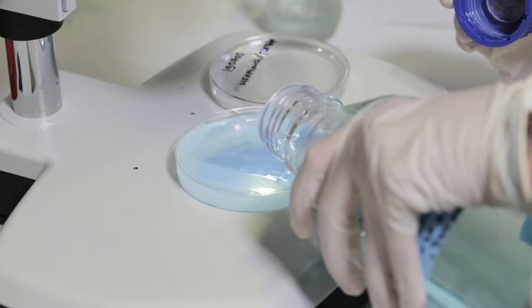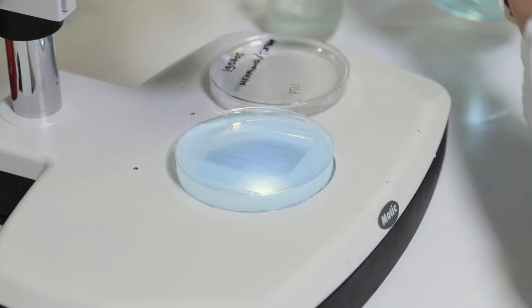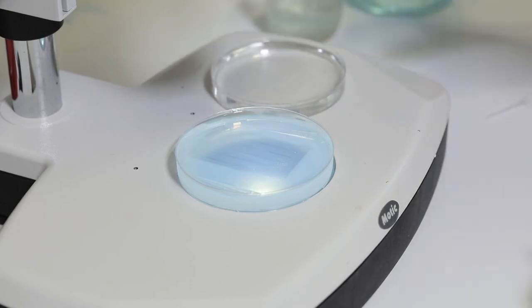We add fish water containing tricaine and place our embryos in the chamber.